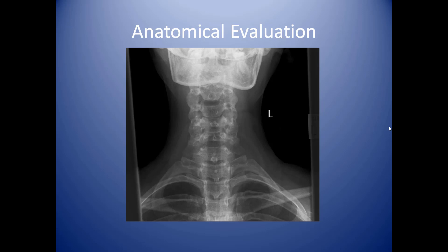Here's a good evaluation of an AP examination. Notice we have the left marker — we're looking at the front of the patient, so that's the patient's left side on your right. We can enumerate the vertebrae; they're the whiter, bony-looking areas. C2 is like a ring with a little thumb sticking up, and C1 looks like a ring that fits down over that thumb. That little dome is a very important part of the cervical spine — make sure you always include it.